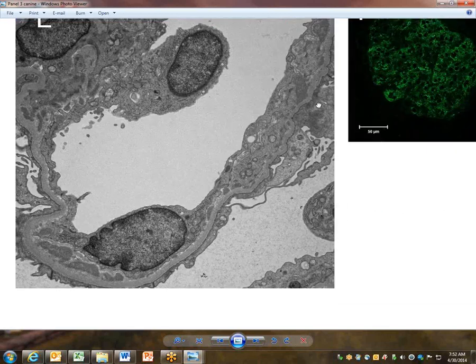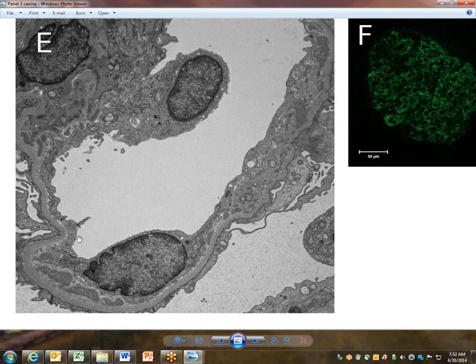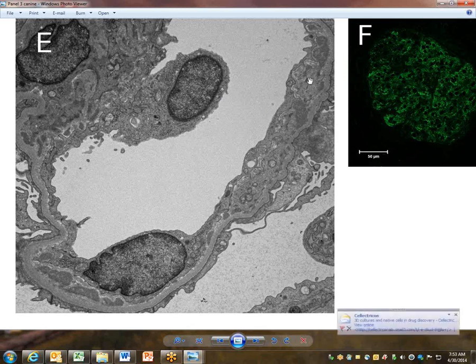Now, they're all in the place where they need to be. Rachel made the point before: when the immune deposits are on this side, the immune amplification system turns on all the complement and recruitment of inflammatory cells and cytokines, everything that makes such an endocapillary cellular reactivity. All that's happening because these are on a side where the bloodstream is bringing all those materials for inflammation to it.